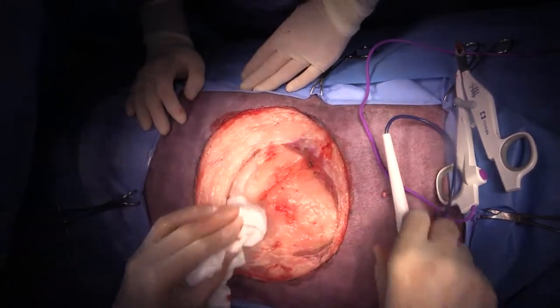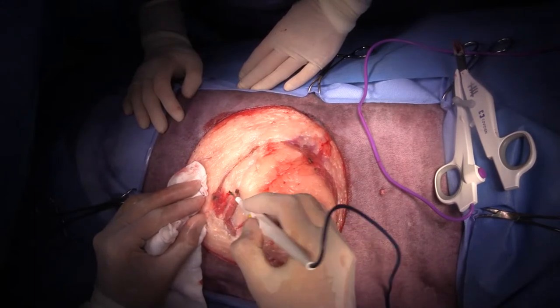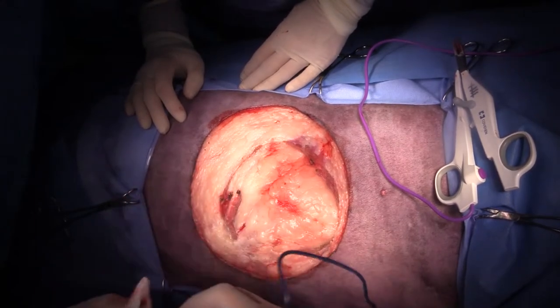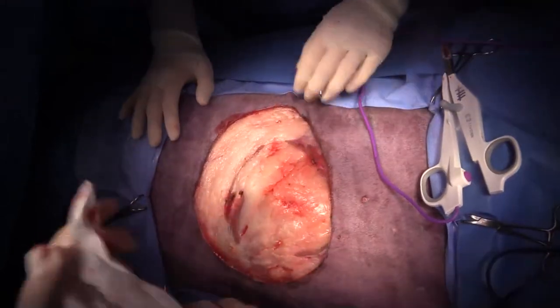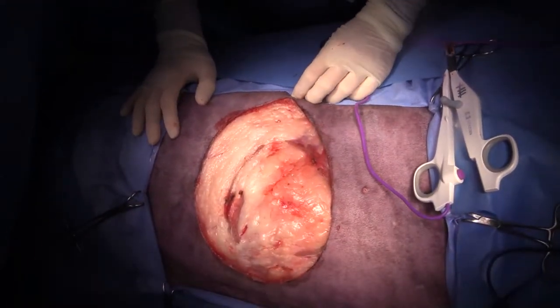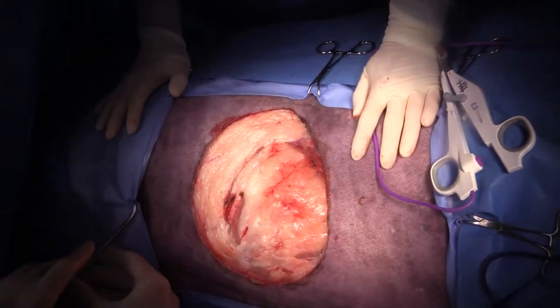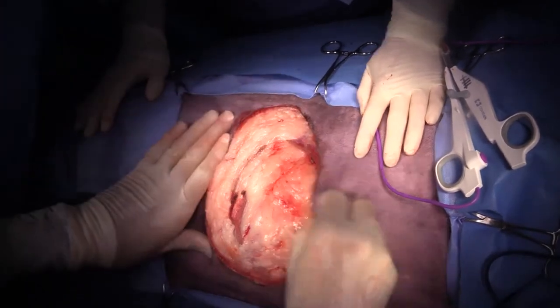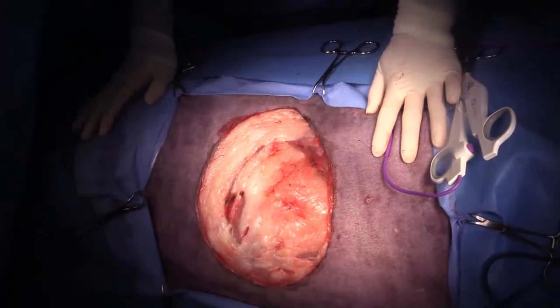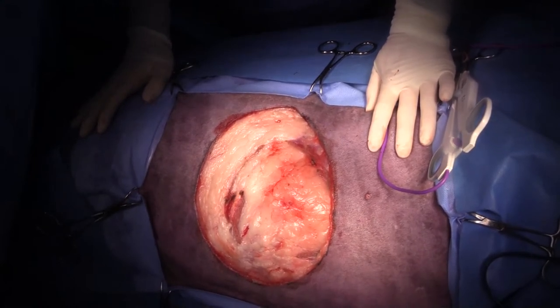Get some mepivacaine, please. And just inject the muscle with mepivacaine, and then we just see how we're going to close this thing. We may end up having to do a flank fold or a Z-plasty in order to reduce the tension. Both sides, yeah. Generally, I'll do both sides.